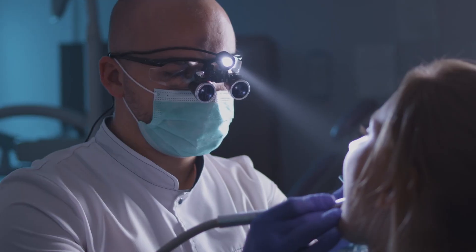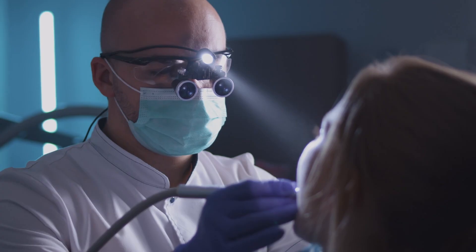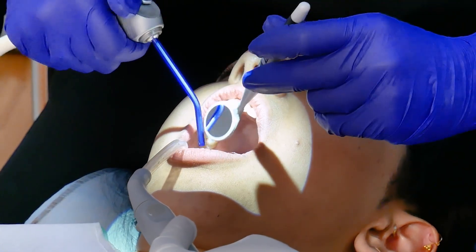The second factor is illumination, and this is where the microscope really shines and has a huge advantage over loops. To use a loop efficiently, we need external lighting which is attached independent of the lenses. The problem is the path traveled by the light is very different from the path traveled by the magnification. With a microscope, it's very different. Microscopes have coaxial illumination, which means the path of magnification is the same as the path of illumination. There is absolutely no shadow when using a surgical microscope — something which loops can never offer.